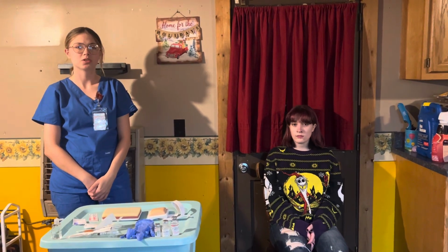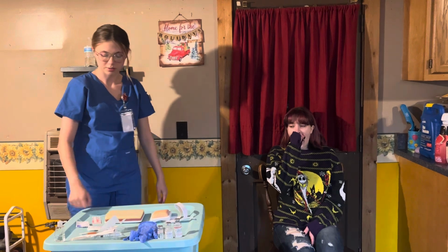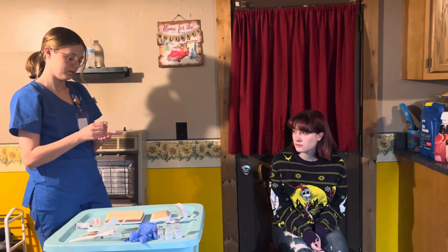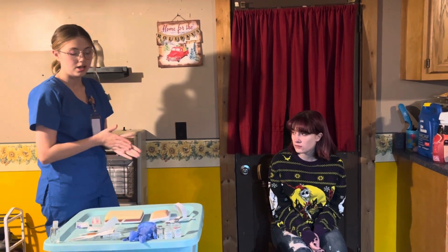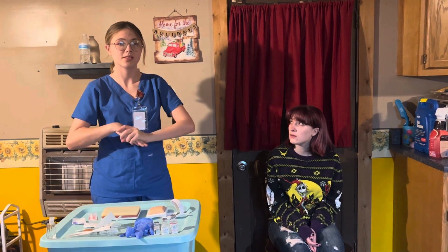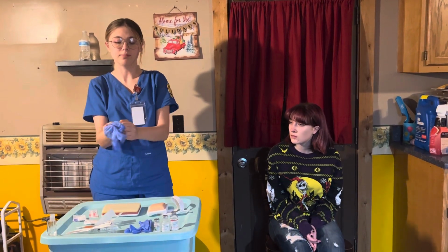Hi, my name is NSG, and today I'll be demonstrating my injection skill. So first, I'm going to knock, perform hand hygiene. I'm going to don clean gloves, and while I'm in the patient's room, I'll be practicing GPSP and the 11 rights of med administration, and I've already done my 3 checks.